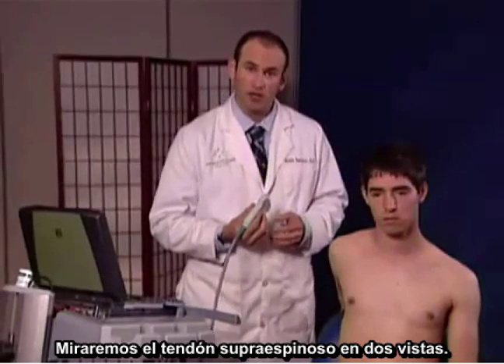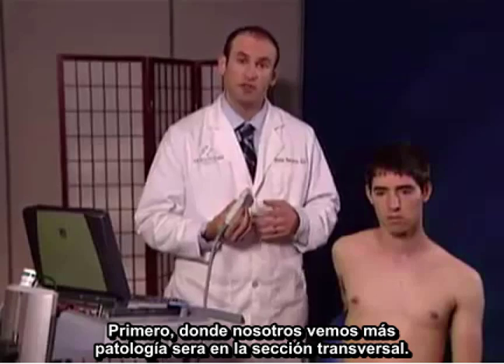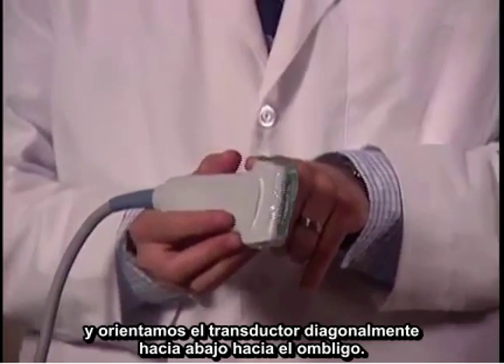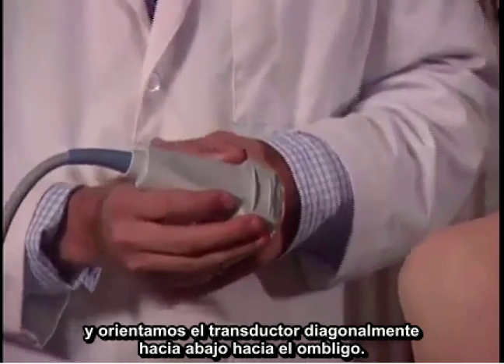There are two views we're going to look at for the supraspinatus tendon. First, where we see most pathology, will be in cross-section. With this technique, we keep the notch of the probe faced upwards and we're going to angle the probe diagonally down towards the navel or the belly button.